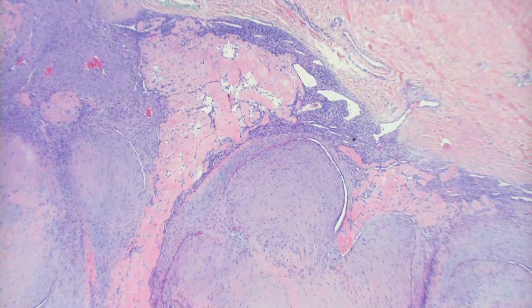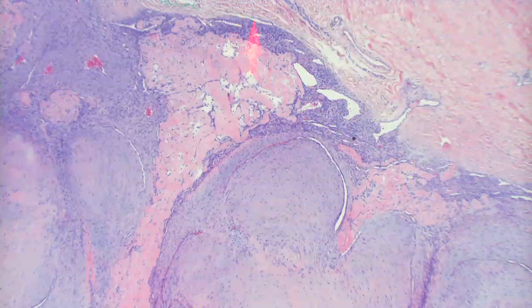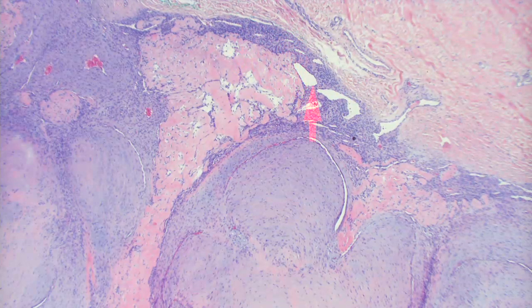And if you stained this, what would it stain for? Like SMA. Yeah, smooth muscle actin. Some people think that the myofibroblasts, the myoepithelial cells, are associated with the vessels or are the cells that may give rise to this. Because there's a little vessel and then this thing is adjacent to it. So that may be what leads to these things.